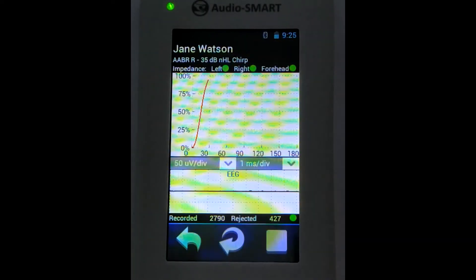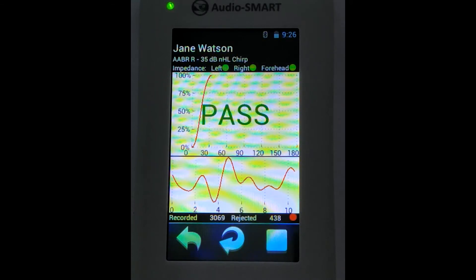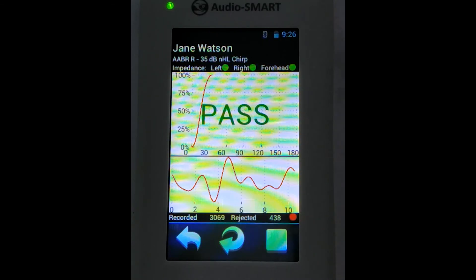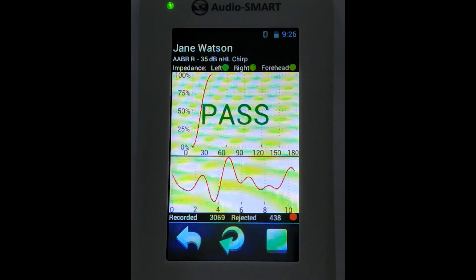Here we see the probability of our response, which is calculated automatically. When it reaches a higher level, we get the result 'pass.' In this test, we don't need any doctor's visual inspection of the curves, as in the ABR test. This test can be performed by technicians or equivalent medical staff.